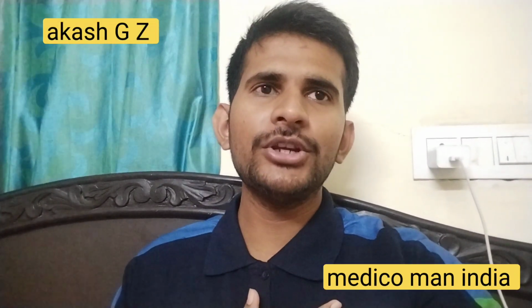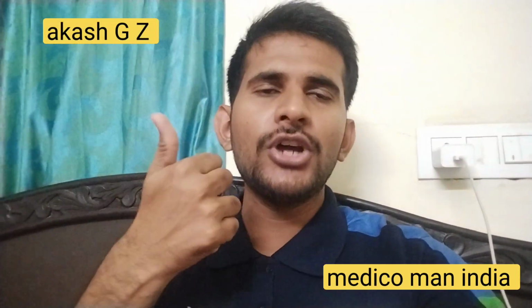So in this video we are going to finish all the orthopedic instruments. I have taken reference from instruments from our college and also from our textbook, and also I have clicked beautiful pictures. My friend helped me to make a good PDF. I have covered all these things and finished all the orthopedic instruments. I hope you like this video and watch until the end. I hope you will enjoy it.